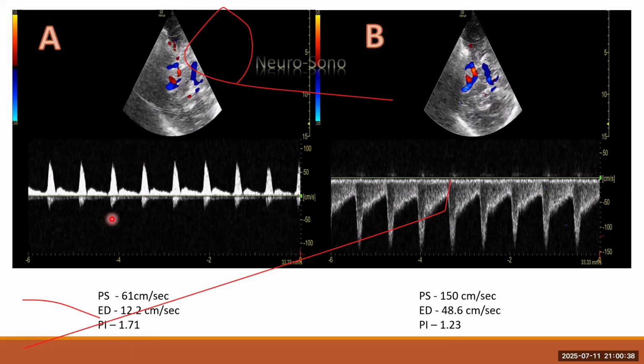When we do a CT, it just gives us an estimate of a global perfusion crisis or a global rise in the pressures, whereas TCD gives us even the local changes in the hemodynamics and the local changes in the pressure.